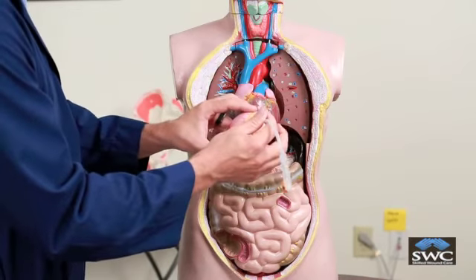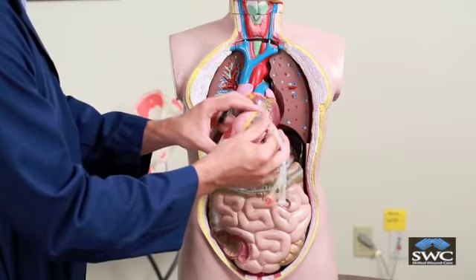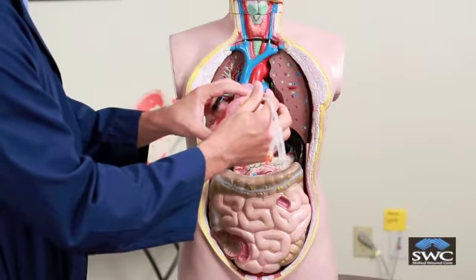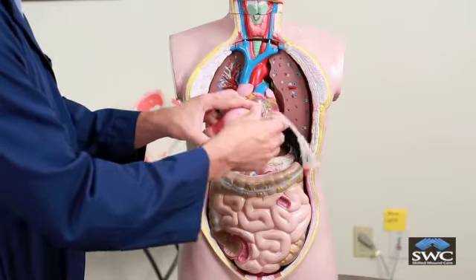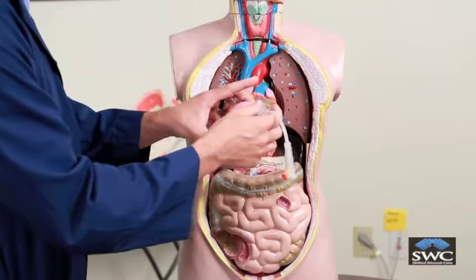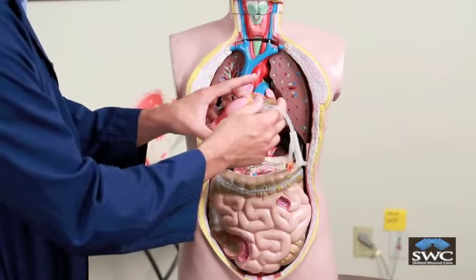The best way to manage that, obviously, is to treat the dermatitis with special skin medications, and at the same time upsizing to a larger gastrostomy tube to cover the area so that there is no leakage there. Now notice, if the tube is missized for the hole, it will always go back and forth, and it could be dislodged a lot of times. So you always want to upgrade the tube if you're changing it.